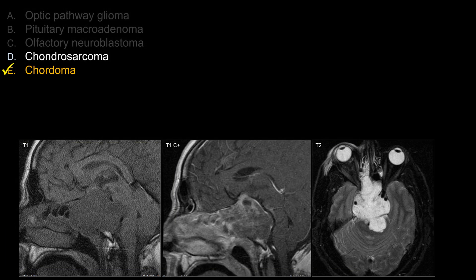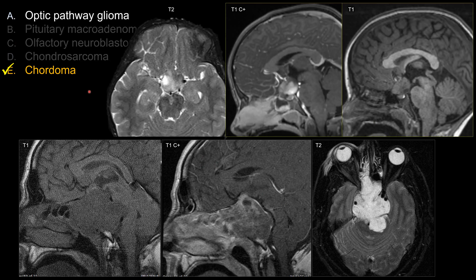What about other choices? Optic pathway glioma: this is a young patient with NF1. On T2-weighted sequence, they are not as bright as chordoma or chondrosarcoma, though there can be cystic changes within that are relatively bright. They can enhance heterogeneously or sometimes show no enhancement; if it's pilocytic astrocytoma, they tend to enhance. Notice the lesion does not involve the clivus — it is centered within the optic chiasm and involves the optic pathway. So the location is not that of chordoma or chondrosarcoma.